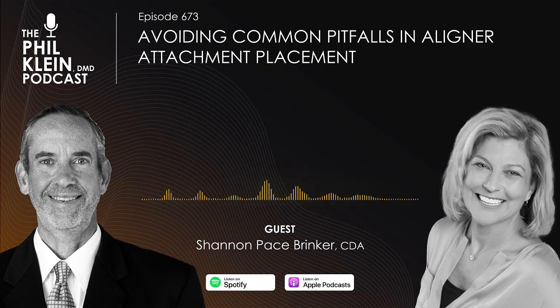So this is an example where it's really important for the curing light to act very quickly. And that's why you recommend in your videos the turbo mode. So 3 seconds, this Tetric EvoCeram aligner is set up. It's rock solid. Okay. Now you've worked across the arch. You're finished. You've done each tooth. All of the attachments are cured.